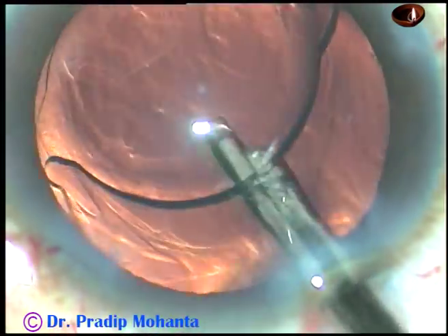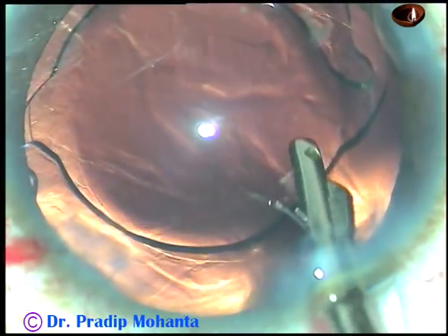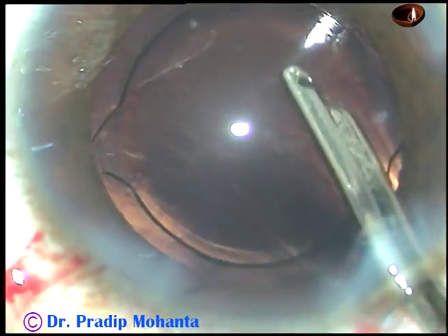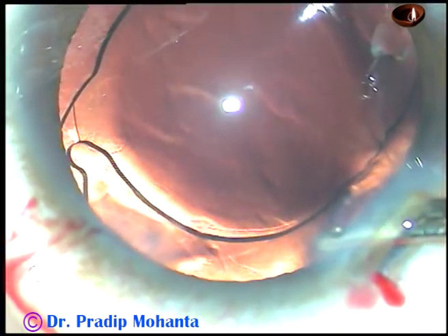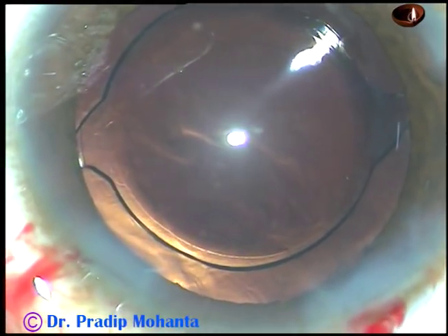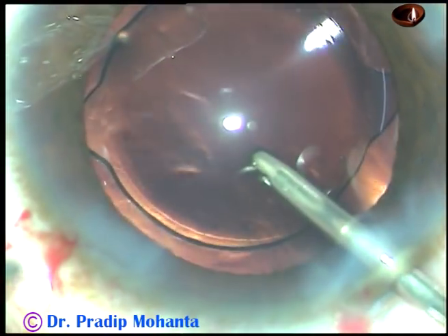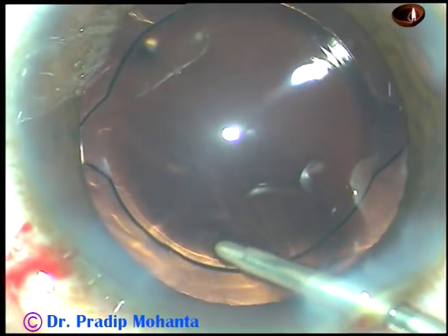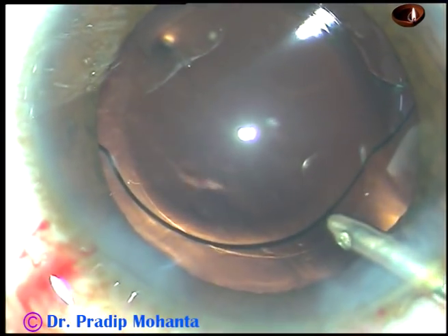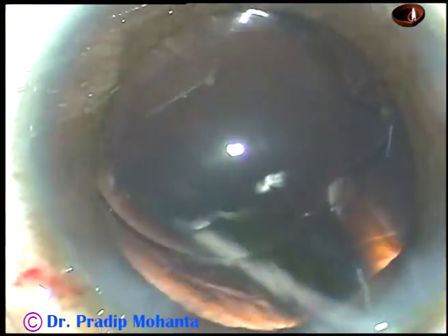Now, visco is being irrigated out by a Simcoe. I call it stage one of visco removal — just irrigate. At the end, after irrigating about five or six ml of BSS, you aspirate for some time. The anterior chamber is kept formed so that AC fluctuations are minimized. This is stage two of visco removal: irrigation by only the irrigating probe of bimanual IA.